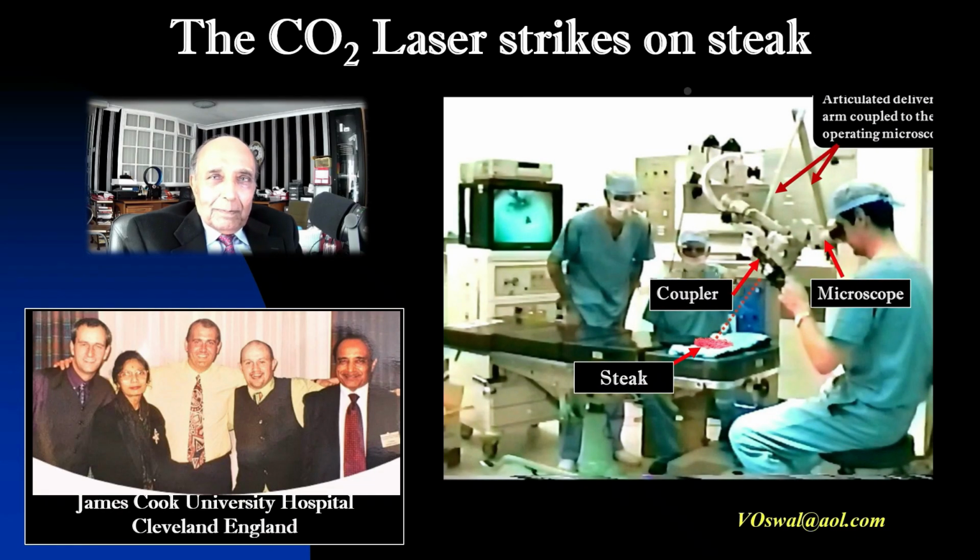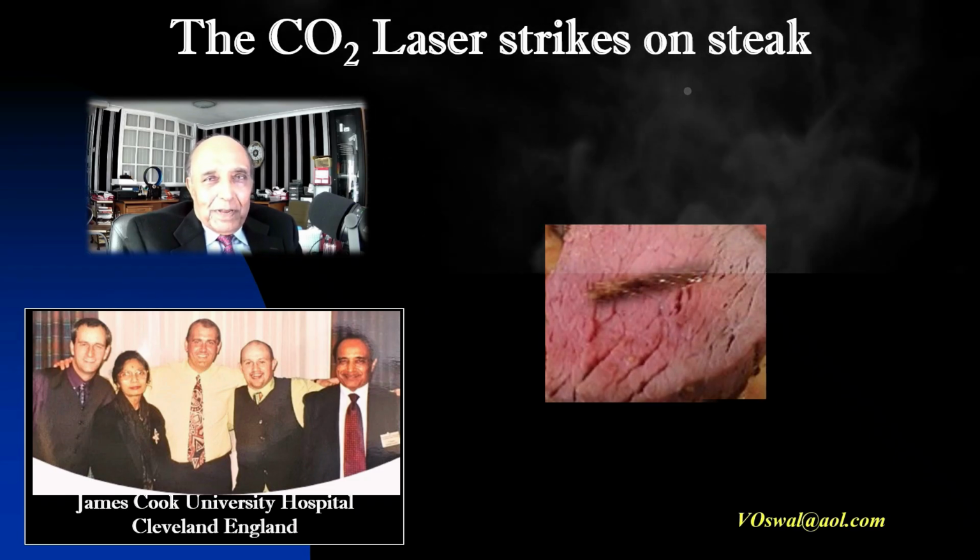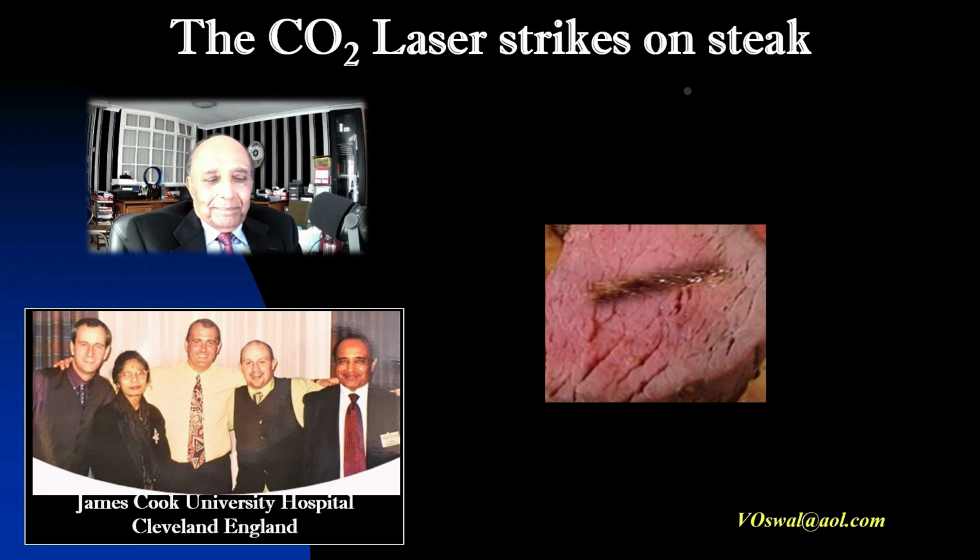We got the laser, we attached the video camera and the operating microscope, got a piece of steak from the butcher's, and I fired the laser beam on its surface. It was an amazing experience. The beam burned the surface of the steak and produced smoke. This was our very first experience of using the laser and seeing the effects.